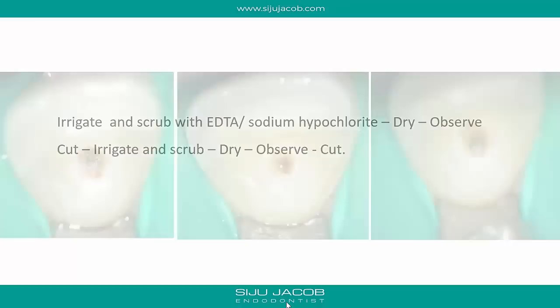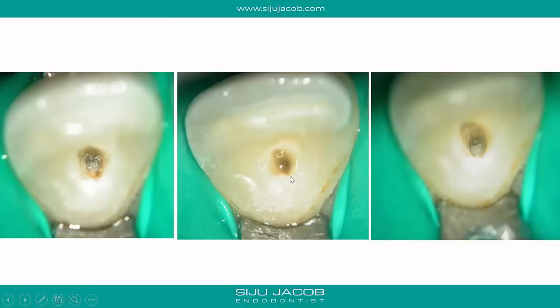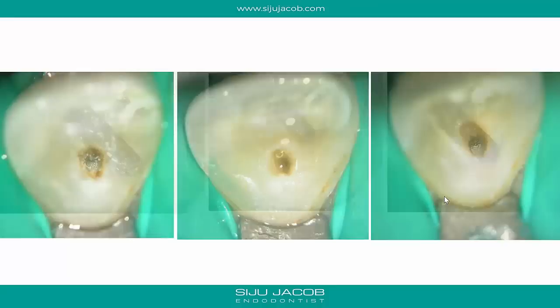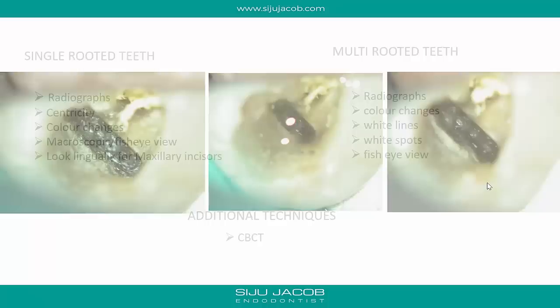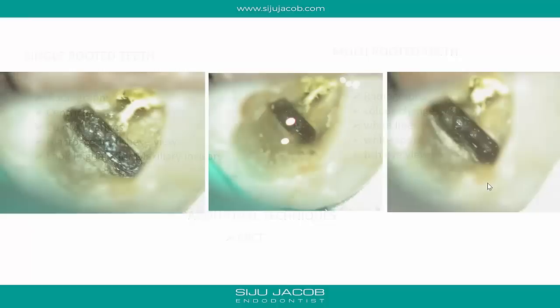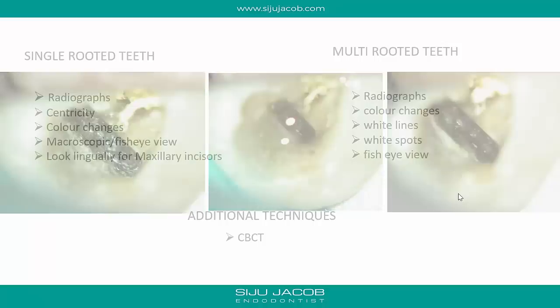Here's an example: when you see the tooth it's completely obscured with debris. I put some EDTA, scrub it with a micro-brush, wash it, dry it and observe — I can clearly see a dark area and a lighter area, so I know the canal is underneath the darker area. Here's another example with a molar referred to me — the cavity is full of debris. I fill it with EDTA, use a micro-brush, scrub out the debris, wash, dry, and when I magnify I can clearly see the darker areas and lighter areas.